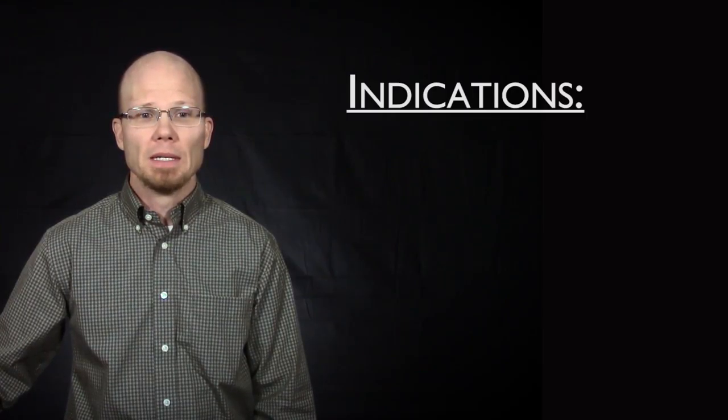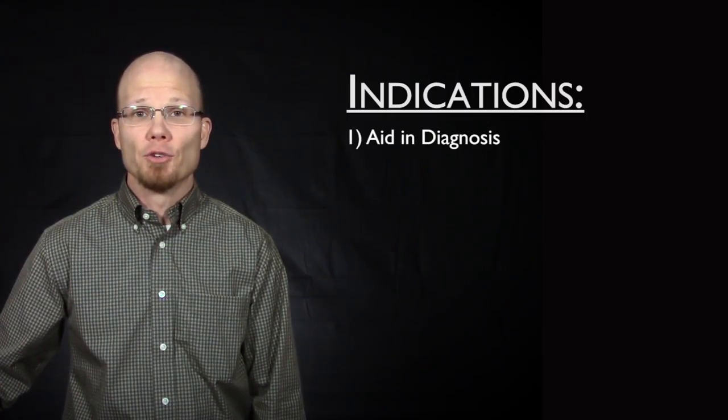Let's first review the indications for spirometry. Number one is to aid in the diagnosis of respiratory disorders. It gives us information about obstructive diseases versus restrictive diseases. Two is to check for presence of disease in the setting of mild symptoms.